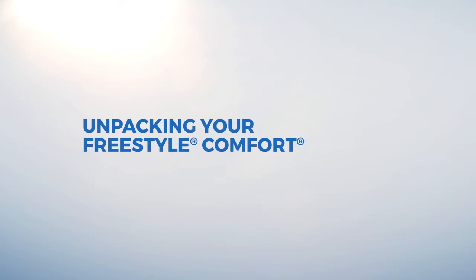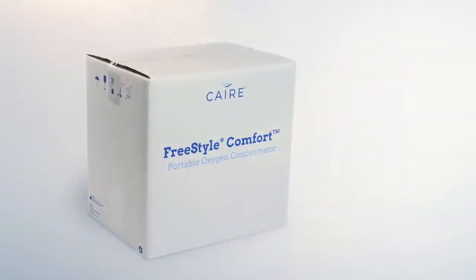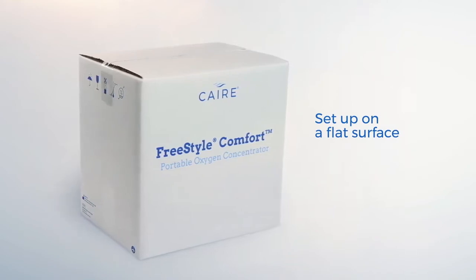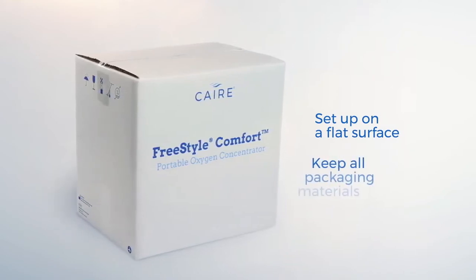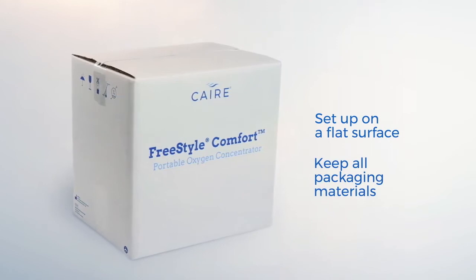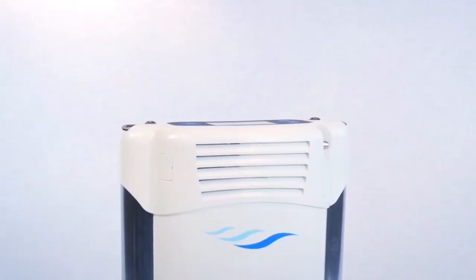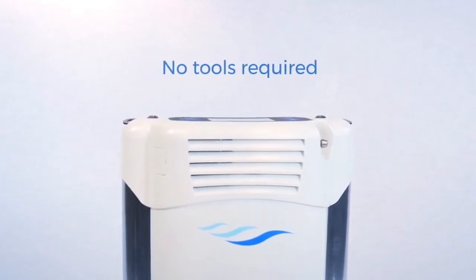When you receive your Freestyle Comfort for the first time, it is best to find a flat surface close to an electrical outlet so you can easily charge your unit. It is also best to keep all packaging materials in a safe place for any potential future needs. Setting up your device is quick and easy and requires no tools.